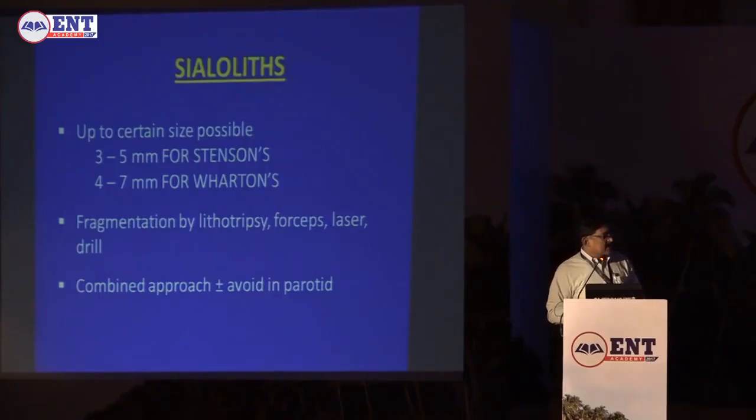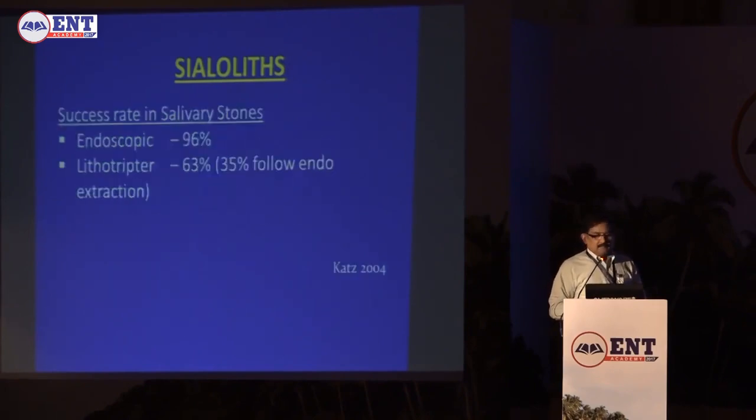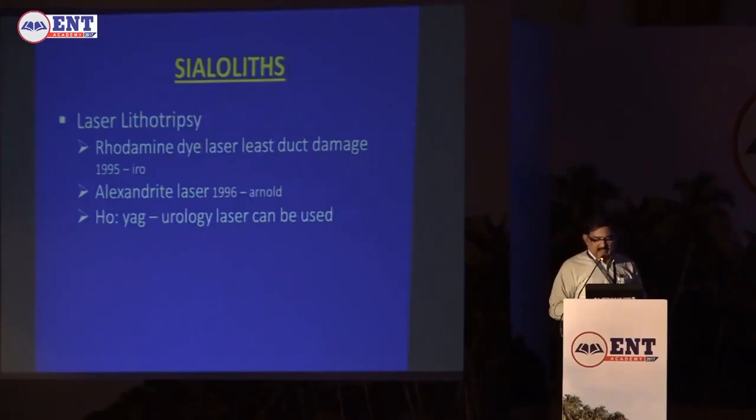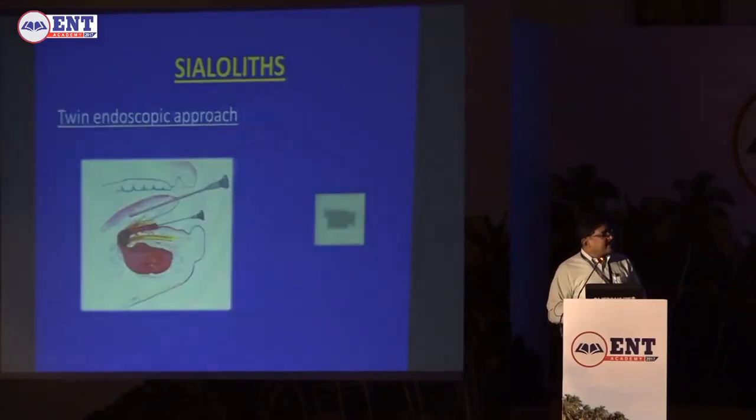Combined approach is possible, but it should be avoided in parotid. So you can also use laser, but it is phenomenally slow. It takes hours to drill through this one with a laser. That is why I started using mechanical drill. So endoscopic success rate is good, but it is not so high when you are starting your career.